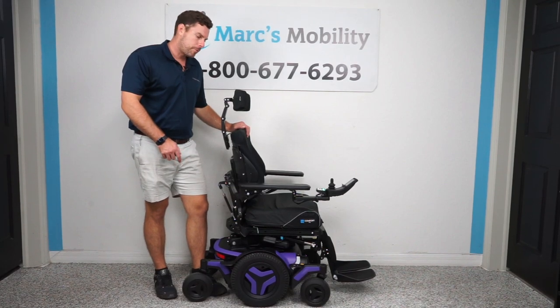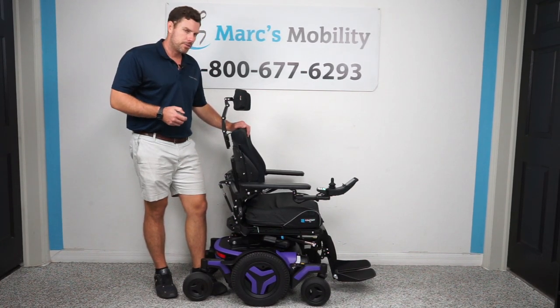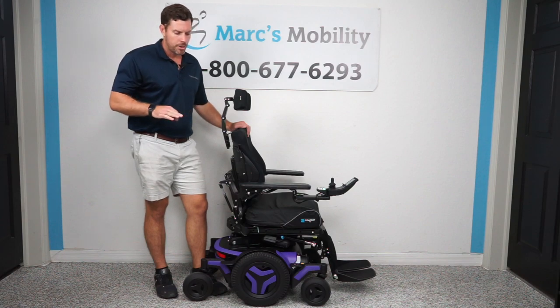This is a Permobil M3, a mid-wheel drive chair made by Permobil, which is a Swedish-based company. No other brand is better than Permobil on the market.